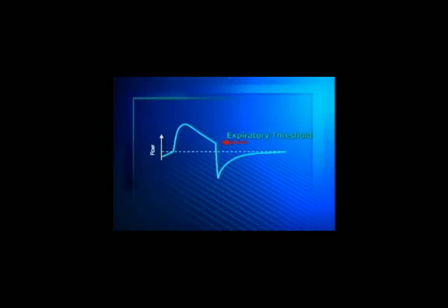Expiratory threshold. The expiratory threshold setting determines the percent of peak flow at which pressure support breaths will cycle to exhalation. Since the rate of flow decay during pressure support breaths is influenced by the patient's pulmonary time constant, the patient's pulmonary time constant will impact breath cycling off timing. Many conventional pressure support systems default to an expiratory threshold setting of 25%.